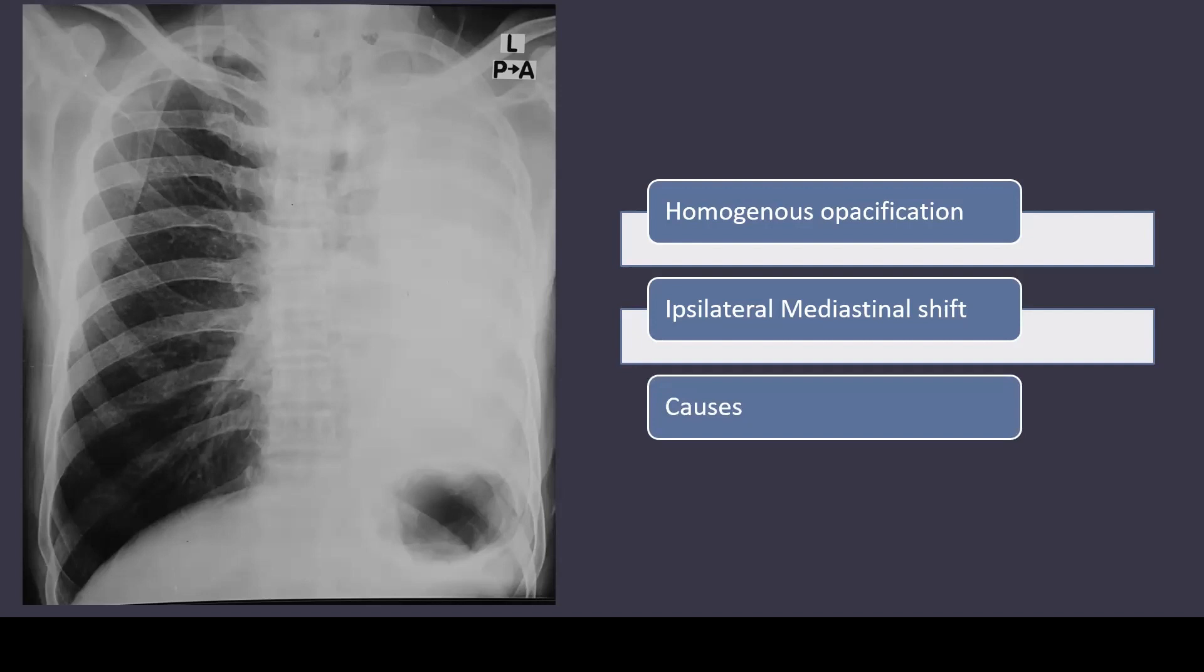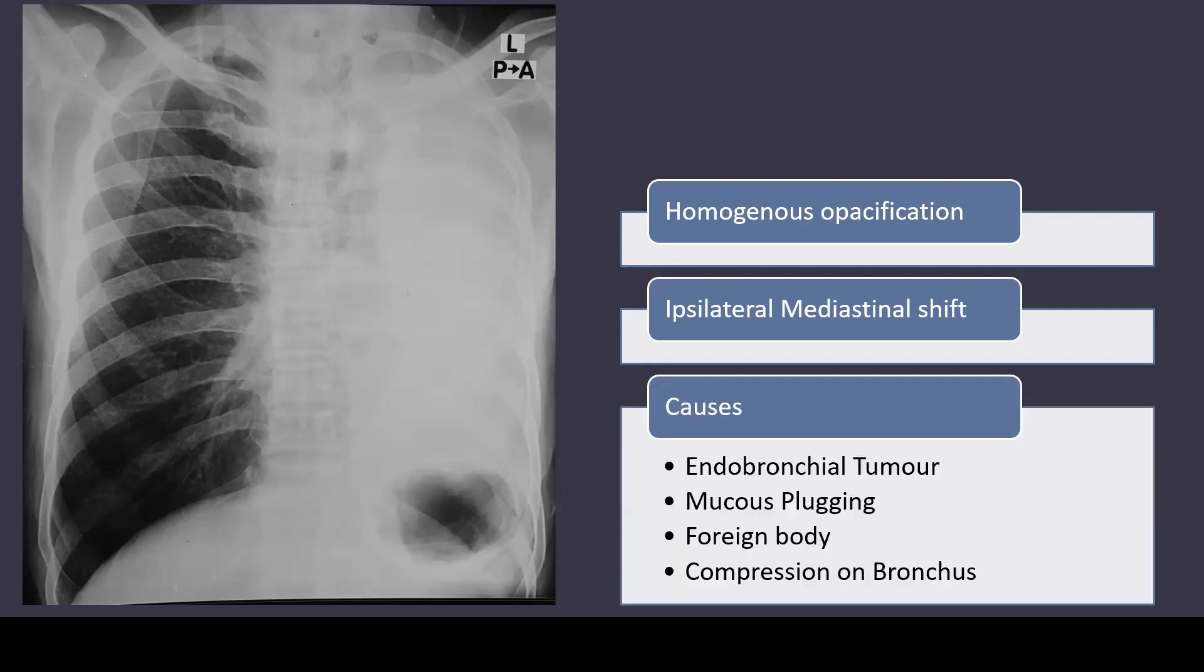The most concerning cause in this case could be an endobronchial tumor which has resulted in collapse of the lung. In this case, there was found to be a left main bronchus tumor which was biopsied by doing a bronchoscopy.